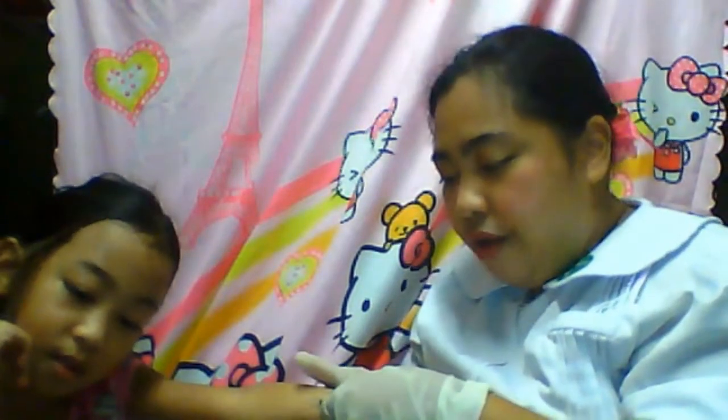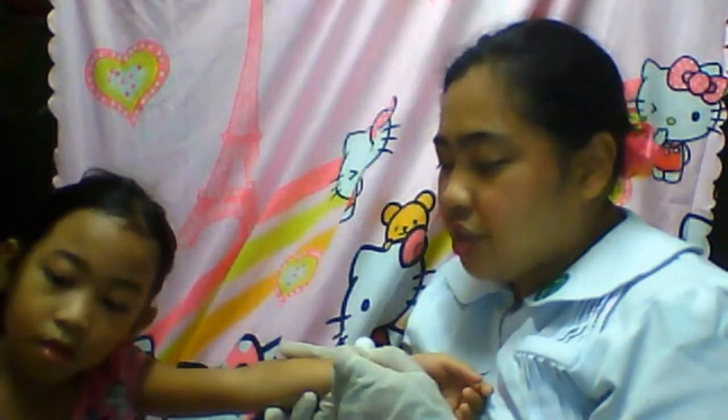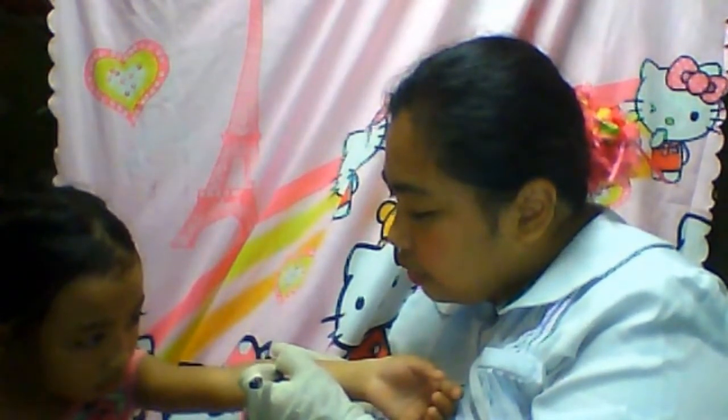Okay, after which, you will get a dry cotton ball to just wipe the excess medication that goes out of the skin. So just wipe it. Do not massage or rub, because that would hinder the accuracy of our skin test. And then once done, you will mark the wheel. For example, we have a wheel here, so you will mark the circled wheel.